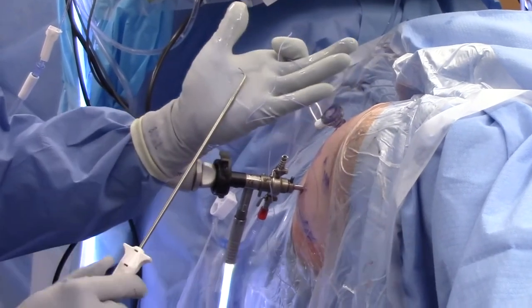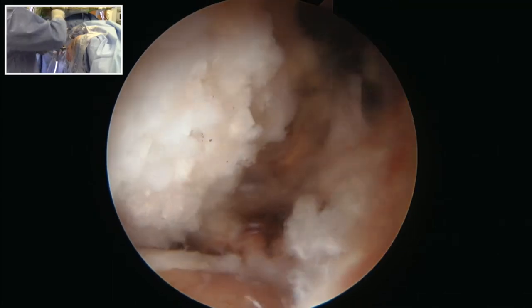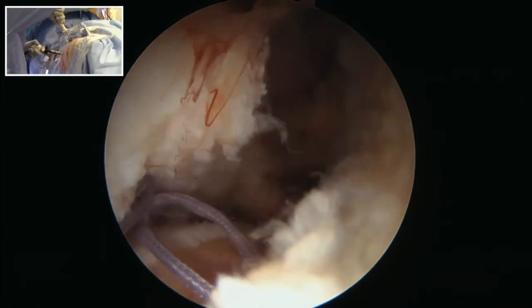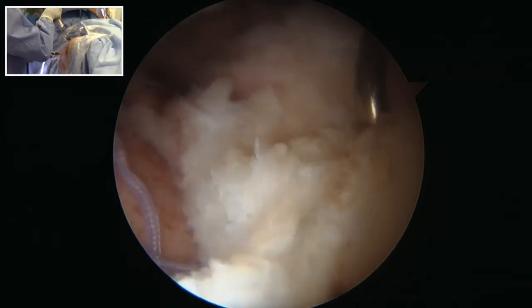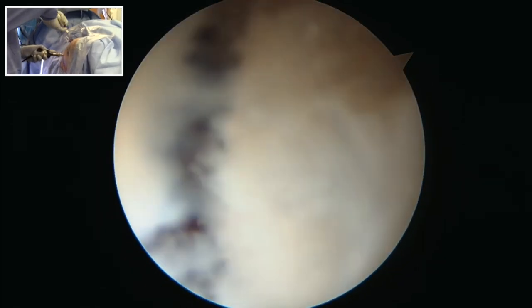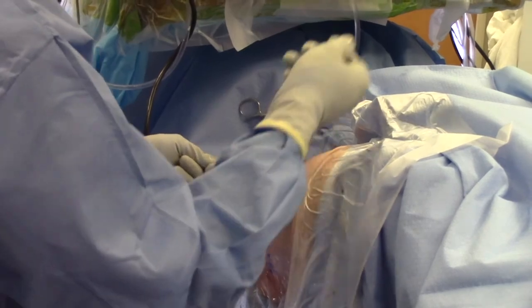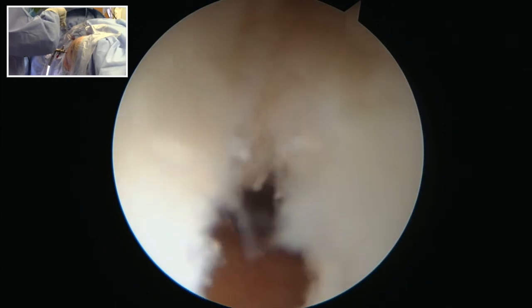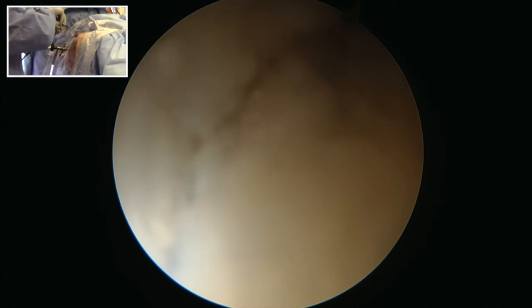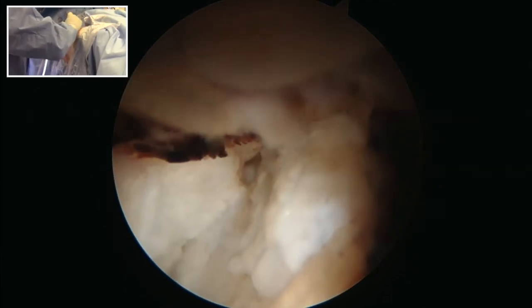The capsule may be closed with Orthocord or Vicryl suture. A capsular closure device is used to pass suture through each limb of the capsule to ensure the capsule is adequately closed. The proximal limb is secured using the suture, and once passed, it is retrieved to the distal limb. You do not want to take large capsular bites because you can over-constrain the capsule. A standard arthroscopic knot is used to secure the capsule. We typically place two to three sutures to ensure a watertight closure. The sutures are cut and the capsulotomy is evaluated to ensure good approximation of the capsule limbs with no residual defects.